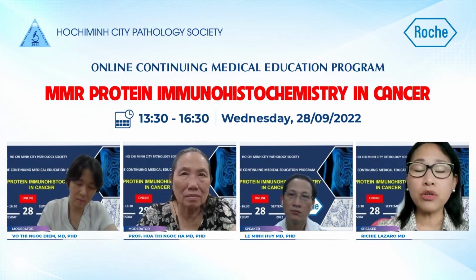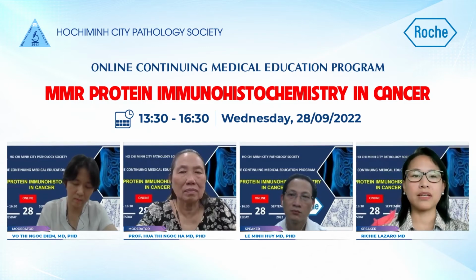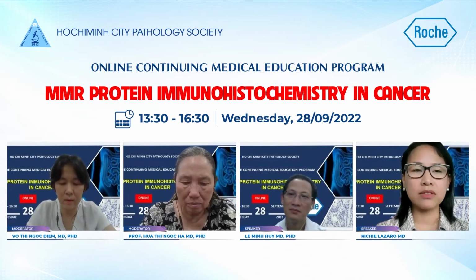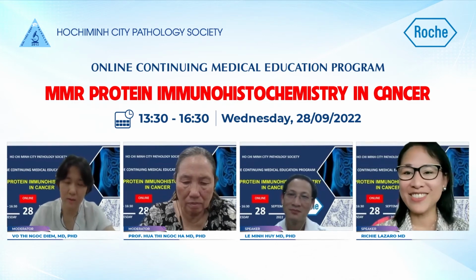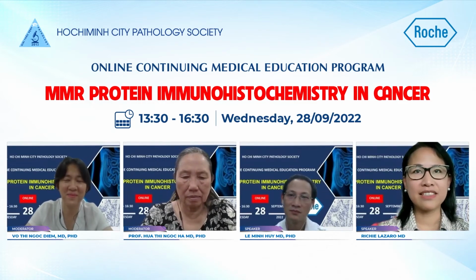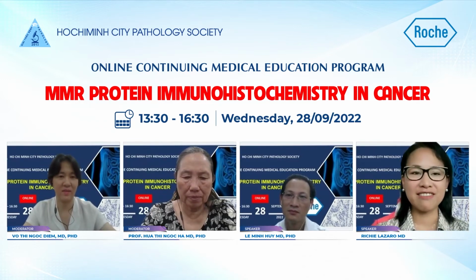I would go for the invasive area for sure. And whether it's poorly differentiated or well differentiated, I'm not so sure. I probably will have to defer this question to someone more experienced in colorectal cancer, for the number 4 question.